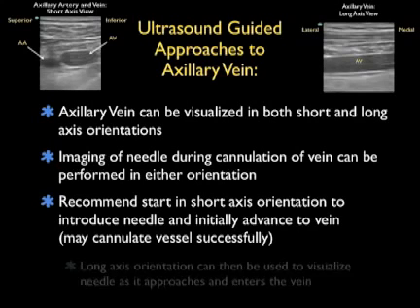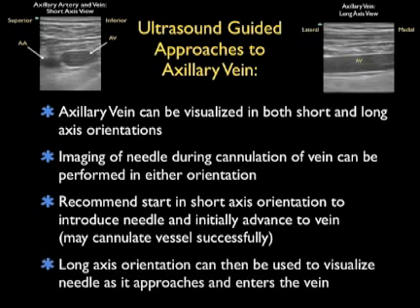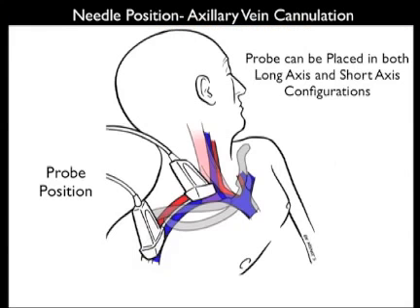I generally recommend to start in a short axis orientation to introduce the needle and initially to advance the needle down to the vein. One may successfully cannulate the vessel in short axis. However, one thing that can be very helpful is to flip the probe once the needle is under the skin into the long axis orientation to be used to visualize the needle as it approaches the vessel, as a long axis orientation shows needle depth better than the short axis orientation.